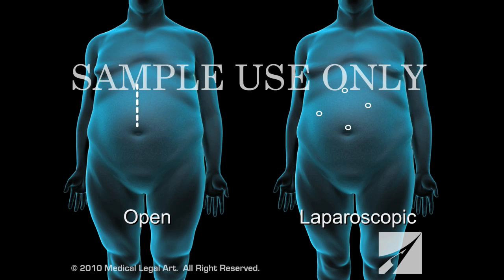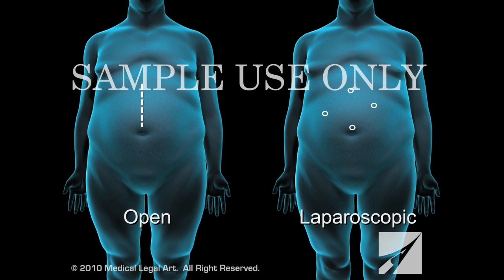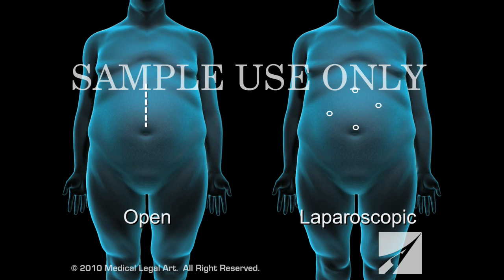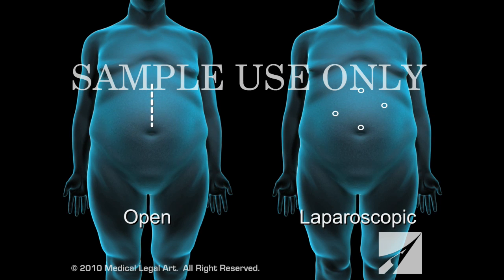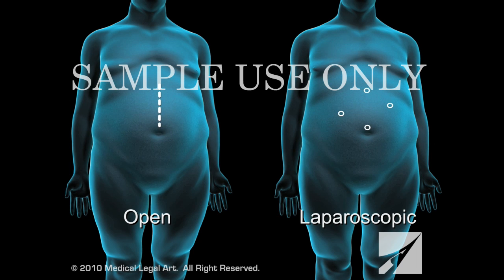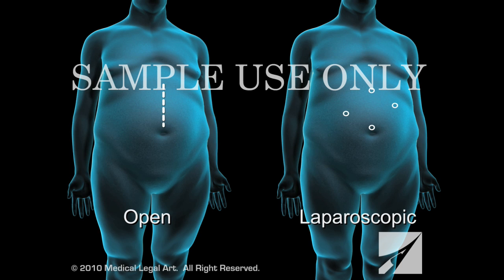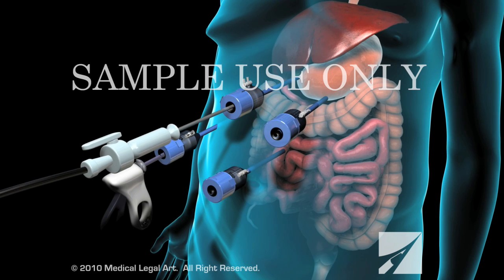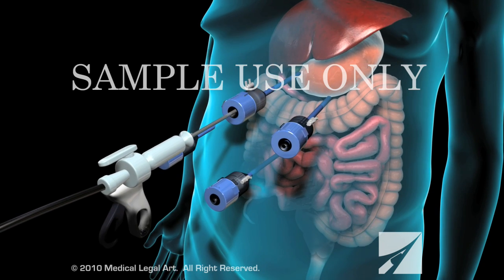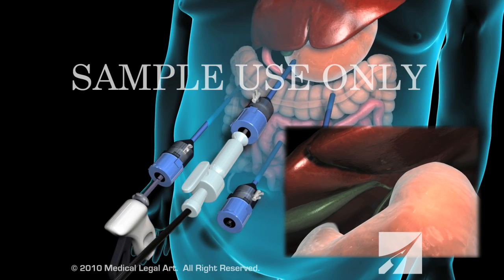Your surgeon will use one of two methods for gastric bypass surgery. The open method requires an 8 to 10 inch incision in the abdomen. The laparoscopic method only requires several small keyhole incisions through which your surgeon will pass a laparoscope and surgical tools. A laparoscope is a thin, lighted instrument that projects images of the surgery on a monitor in the operating room.